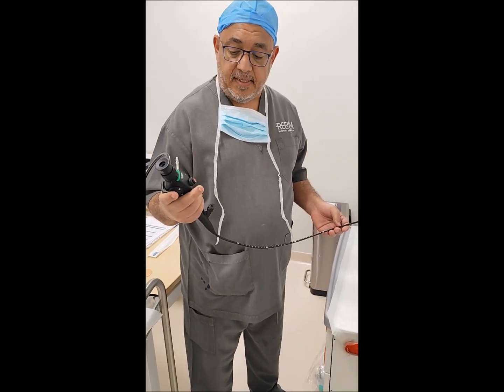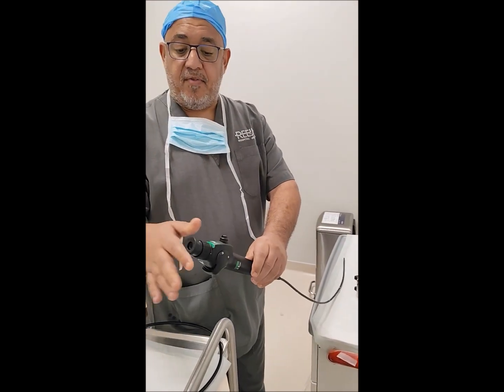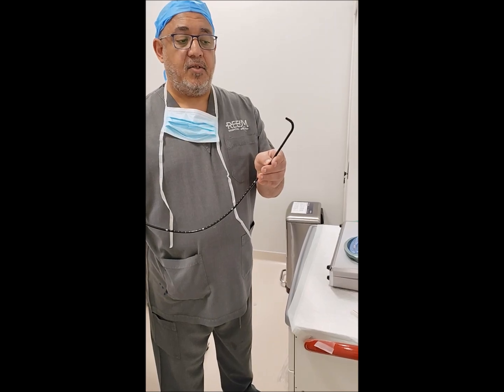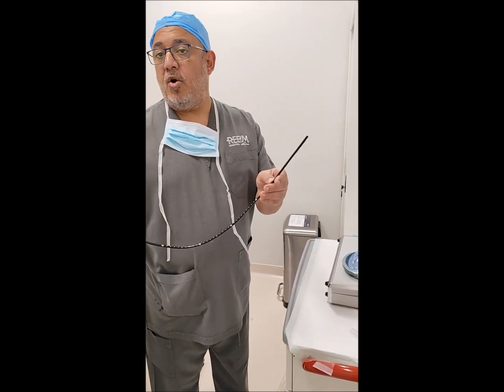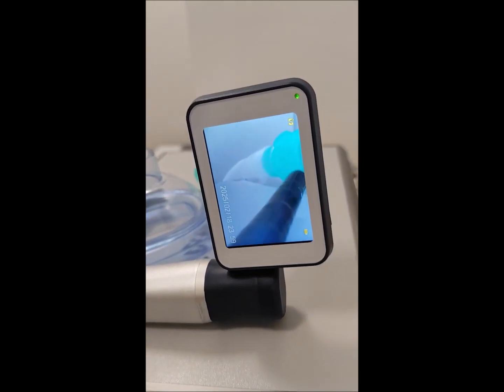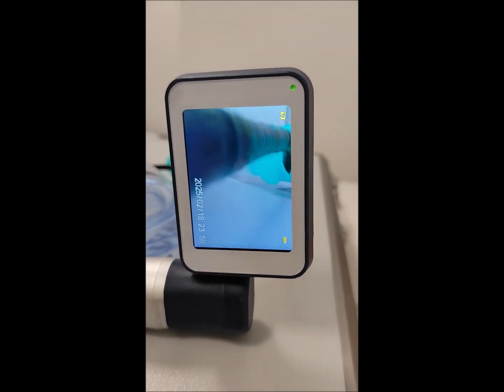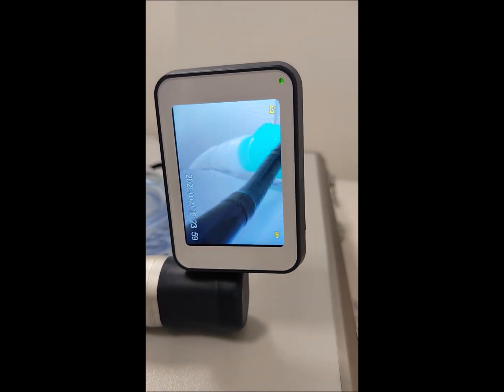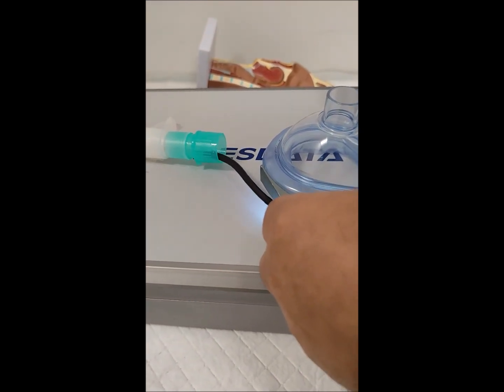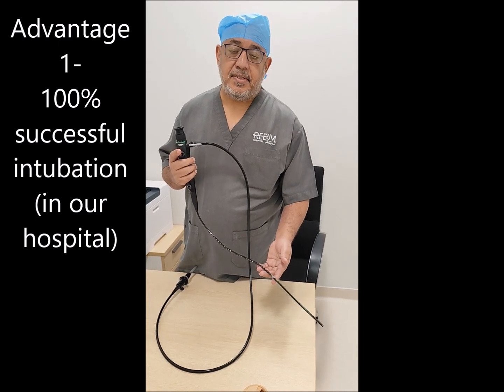The third technique, which I think is the most suitable and most successful, is to add the fiber optic. In this technique we do not use the screen or camera of the fiber optic — we use it just as a guide wire or guide for the tube. The tip acts as a guide so we can adjust it, which is an advantage you will not find with the Bougie or the stylet. As you can see in the camera, we go inside with the fiber optic, adjust the tip which may initially be very high, and then advance it into the tube. The fiber optic gives almost 100% success rate in cases of high larynx.